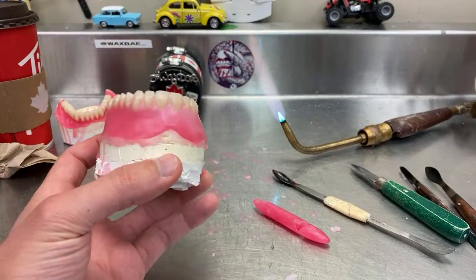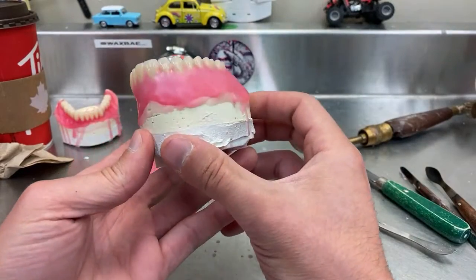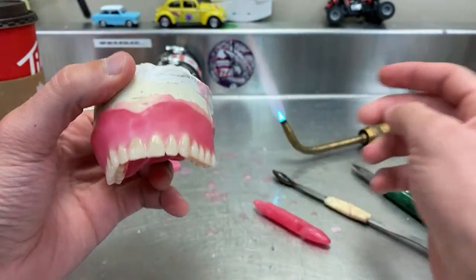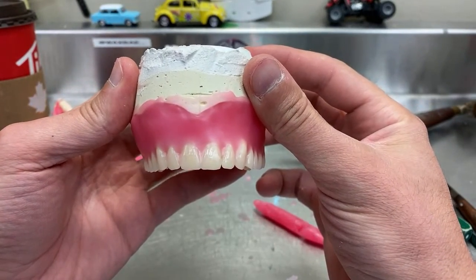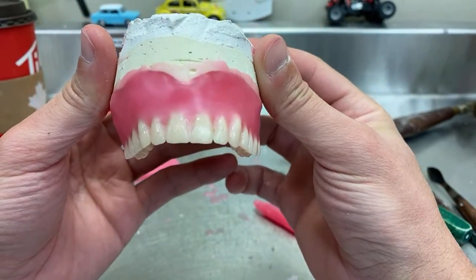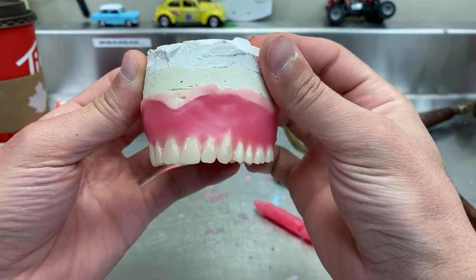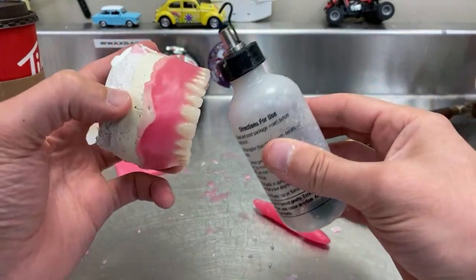Okay, so this is now, basically that's how I want it, but at the same time, it does not have wax in the places that I will need. For example, you inspect, how is your wax up here? So when you look at it that way, can somebody, let's try that. Can somebody tell me where it needs wax? Just by looking at it. I have explained that before in a live video as well.